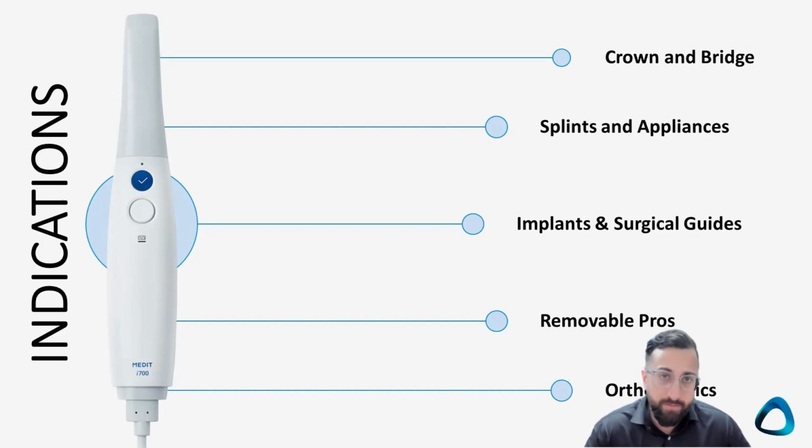As I mentioned in a previous webinar, the only indication where you don't use a scanner, or you need an adjunct, or you may use impression material, is if a patient comes in completely edentulous and they want dentures. That is the only time I would take an impression. If they have teeth and it's an immediate denture, I scan that. But really the only time is a completely edentulous patient, because you're not going to get a functional impression from a scan. You take a physical impression, but then you can scan that.